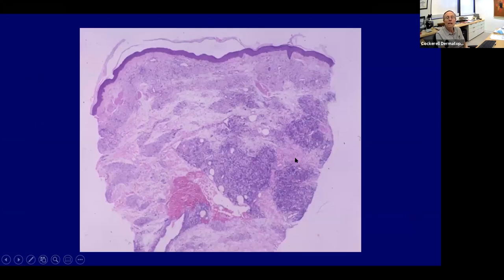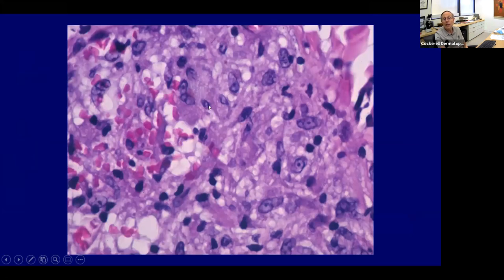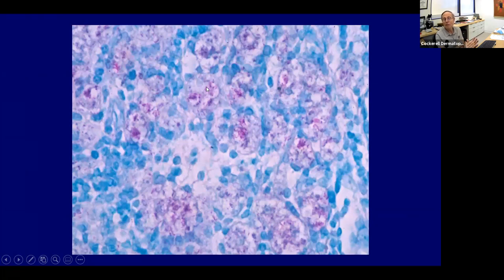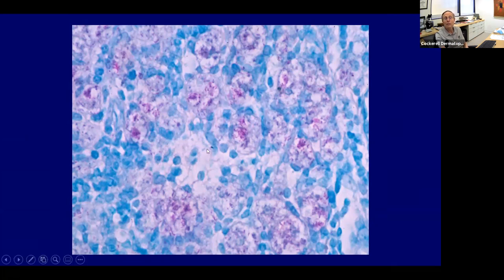Here's an example of lepromatous leprosy at low magnification: pale foamy cytoplasm in many histiocytes with some lymphocytic infiltrate. A Fite stain will be strongly positive — this is multibacillary disease with a high bacterial load. These patients are prone to get reactions when you start treatment, so they need to be on thalidomide and agents to prevent severe neurologic reactions. They can also get erythema nodosum leprosum.